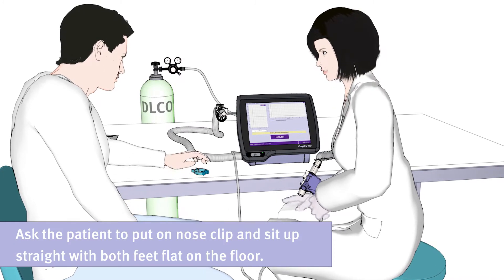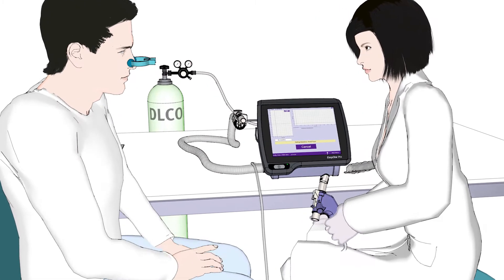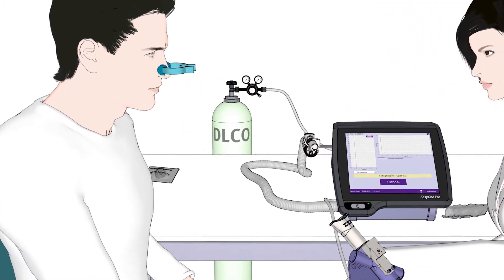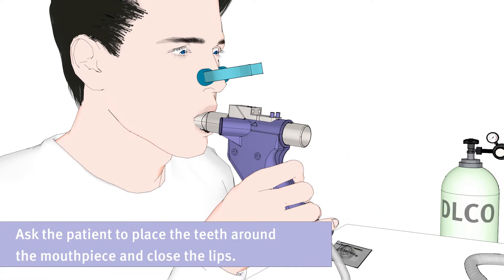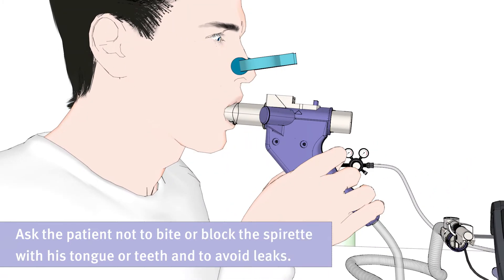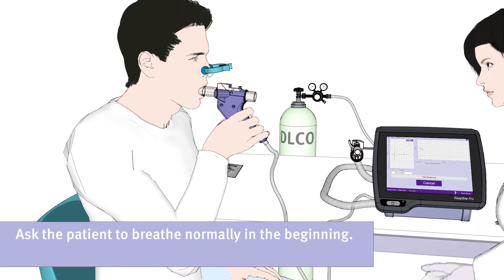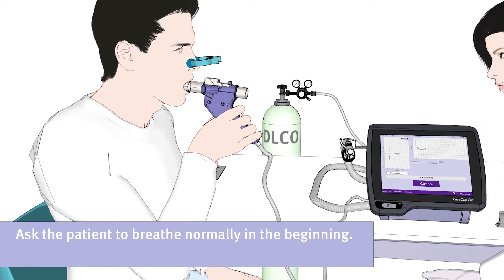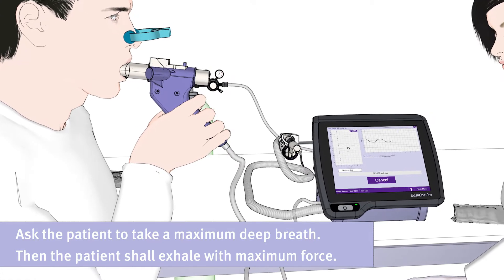Ask the patient to put on the nose clip and sit up straight with both feet flat on the floor. Now, ask the patient to place their teeth around the mouthpiece and close their lips. Please ask the patient not to bite or block the spirette with his tongue or teeth and to avoid leaks. The patient should breathe normally in the beginning, then should take a maximum deep breath, and should then exhale with maximum force.